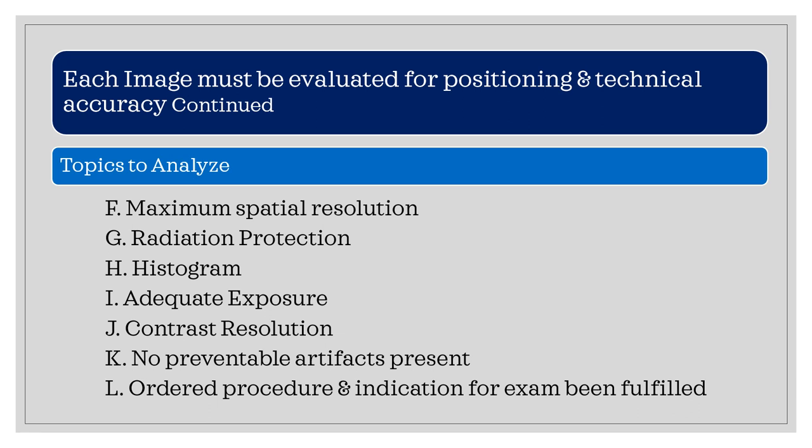Each image must be evaluated for positioning and technical accuracy, continued. Maximum spatial resolution, radiation protection, the histogram, adequate exposure, contrast resolution, no preventable artifacts present, the ordered procedure and indication for the exam has been fulfilled.